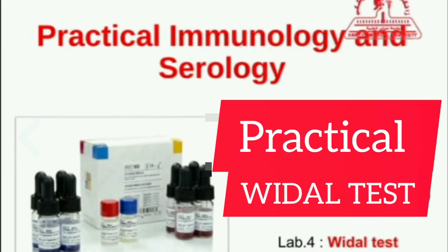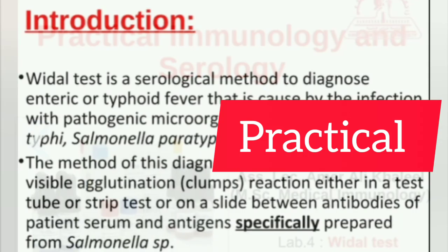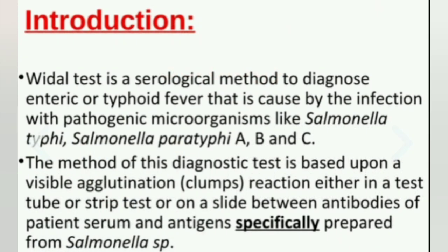Our medical technology community today will discuss the Widal test. Basically, a Widal test is a serological method to diagnose enteric or typhoid fever that is caused by infection with pathogenic microorganisms like Salmonella typhi and Salmonella paratyphi A, B, and C.